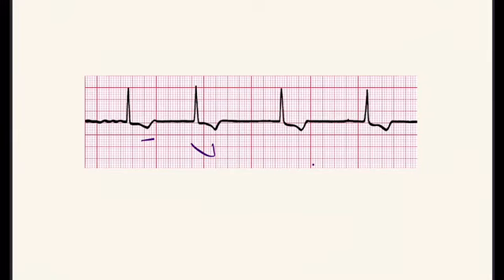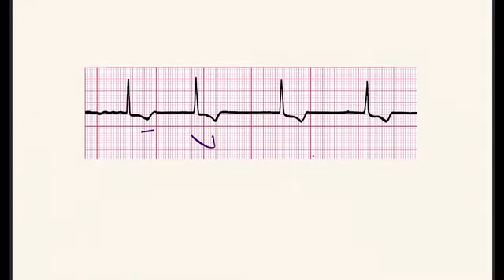Now if there is more potassium, there will be more repolarization and the T wave will be more peaked. This T wave gets its peak from the ST segment, so the length of the ST segment will decrease. Also, low plasma calcium level can cause prolongation of the QT interval, and a high plasma calcium level shortens it. That is also a finding you can get from this.